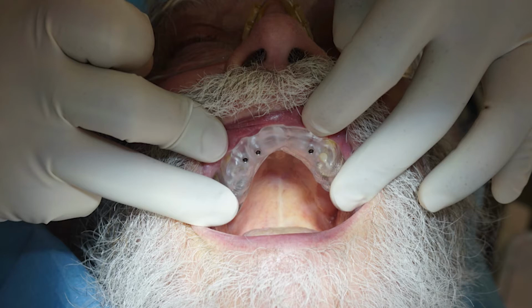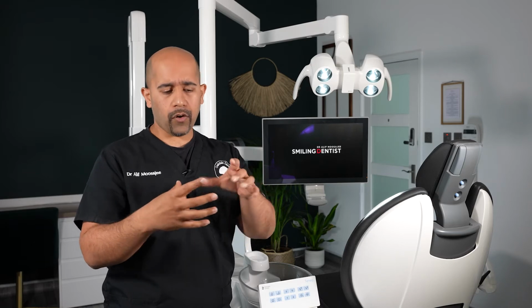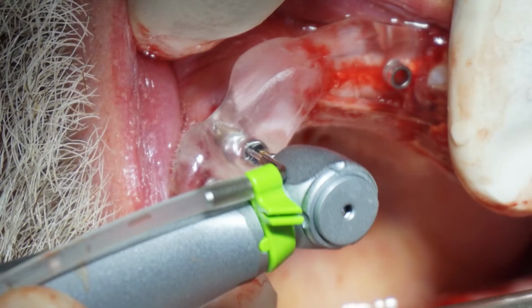Let's say the morphology does allow you to place the implant, then one of the things I always do for my treatment is to make a guide. And the reason I want to do that is I want to make sure that when I have planned that the implant needs to go into a certain place, I would like my hand held a little bit so that on the day of surgery, I've got a guide, I've got a tool that's going to force me to put the implant into that correct position.